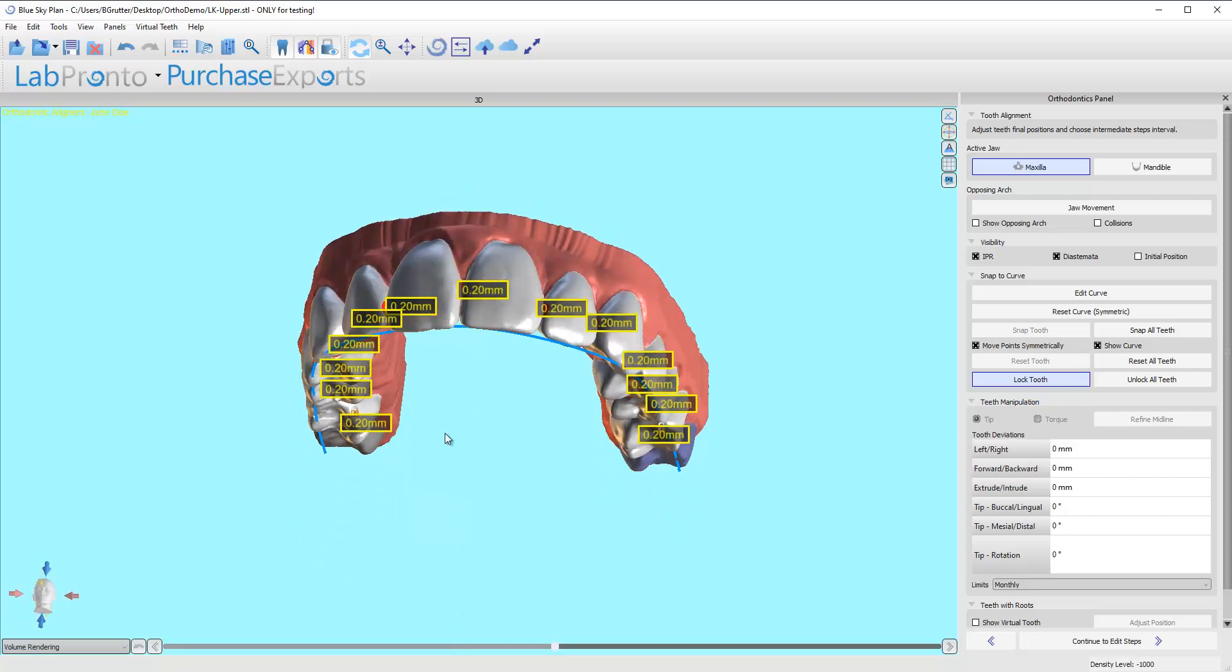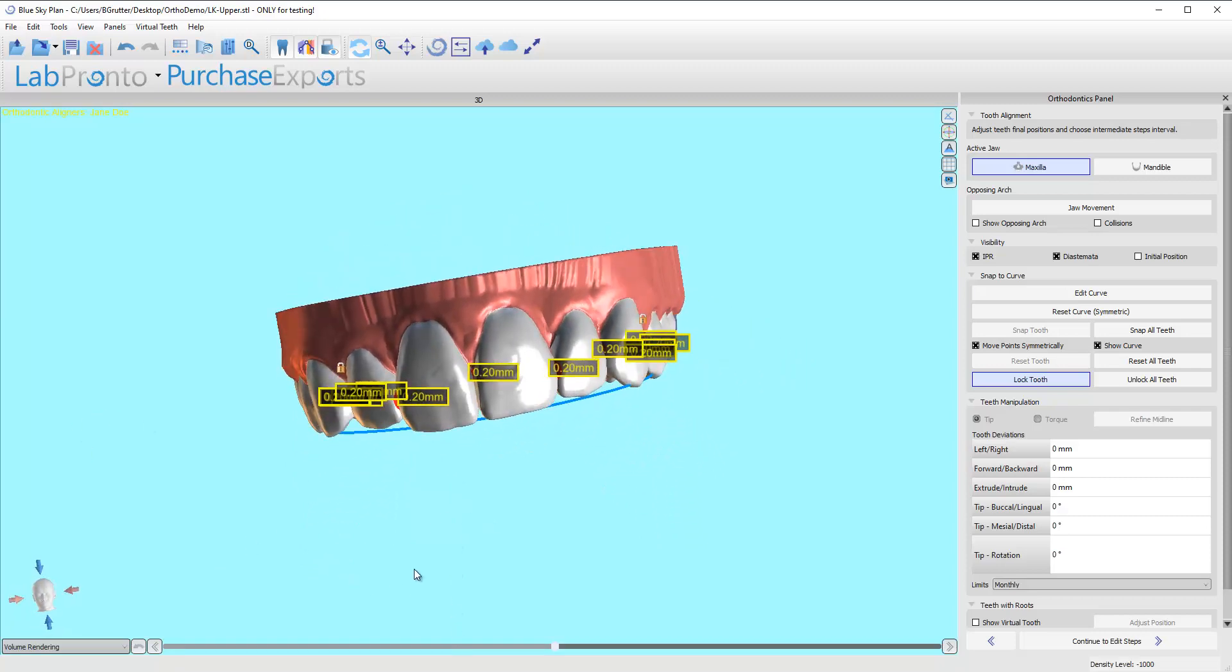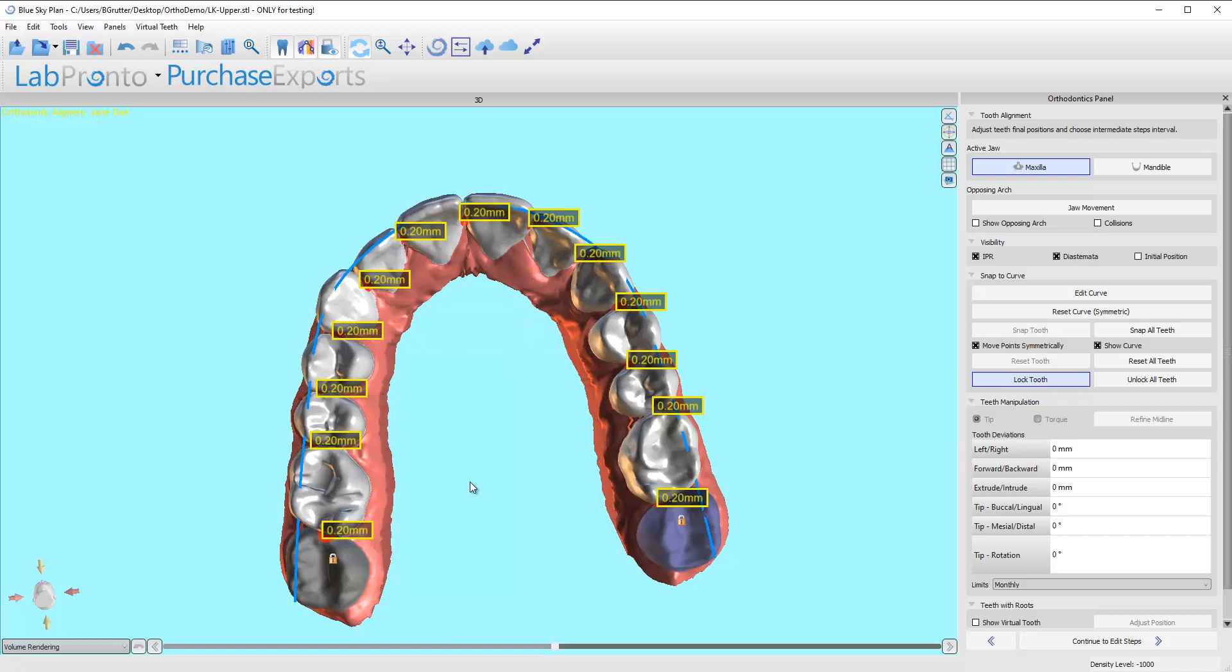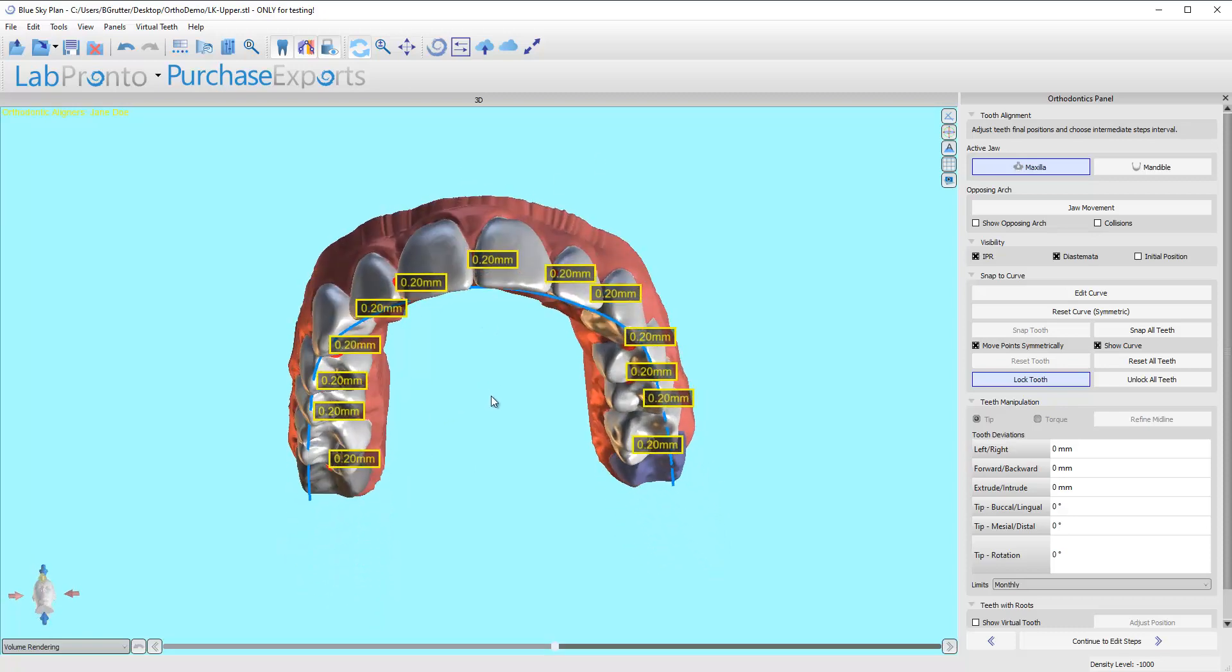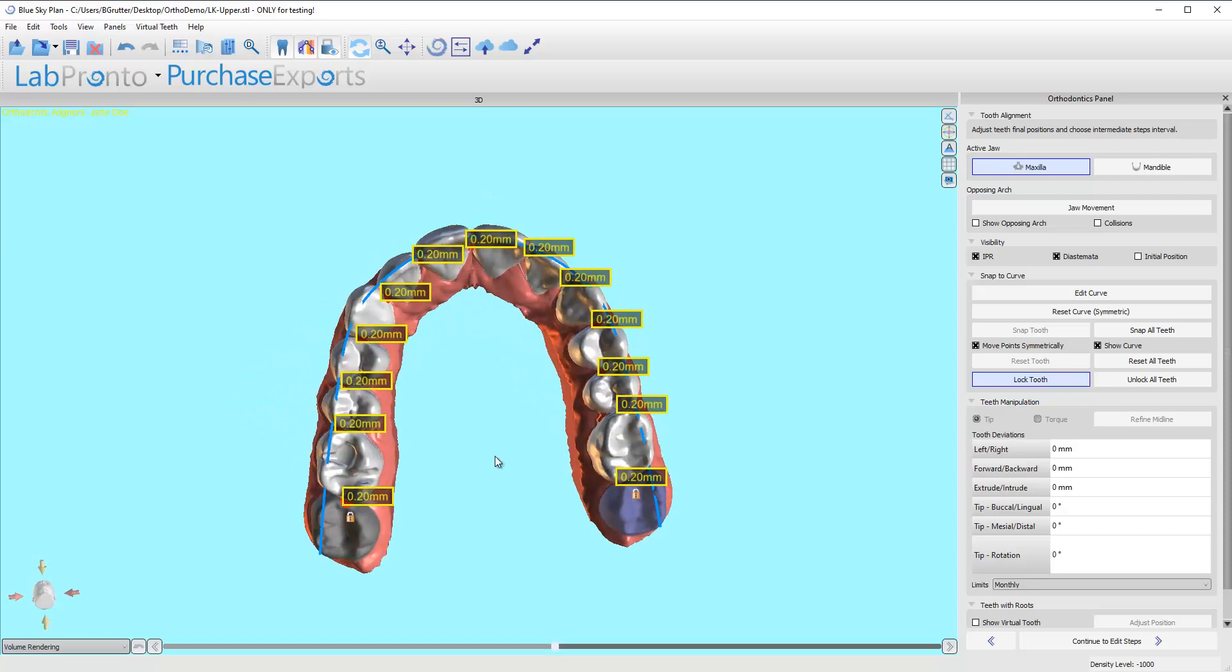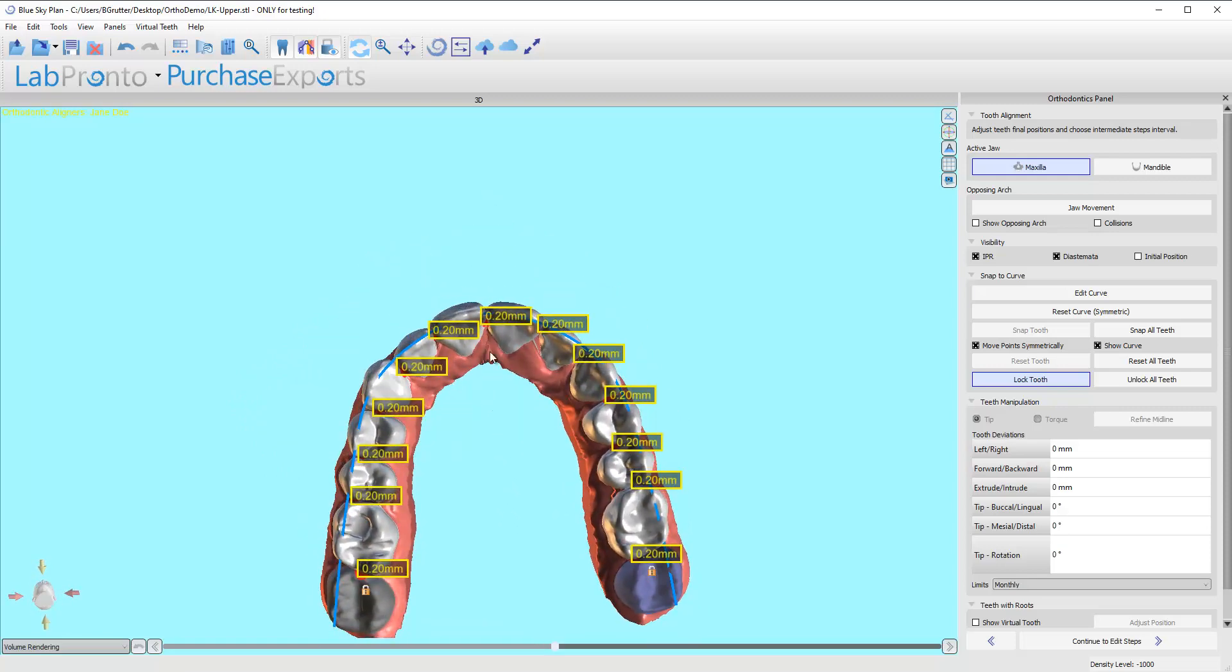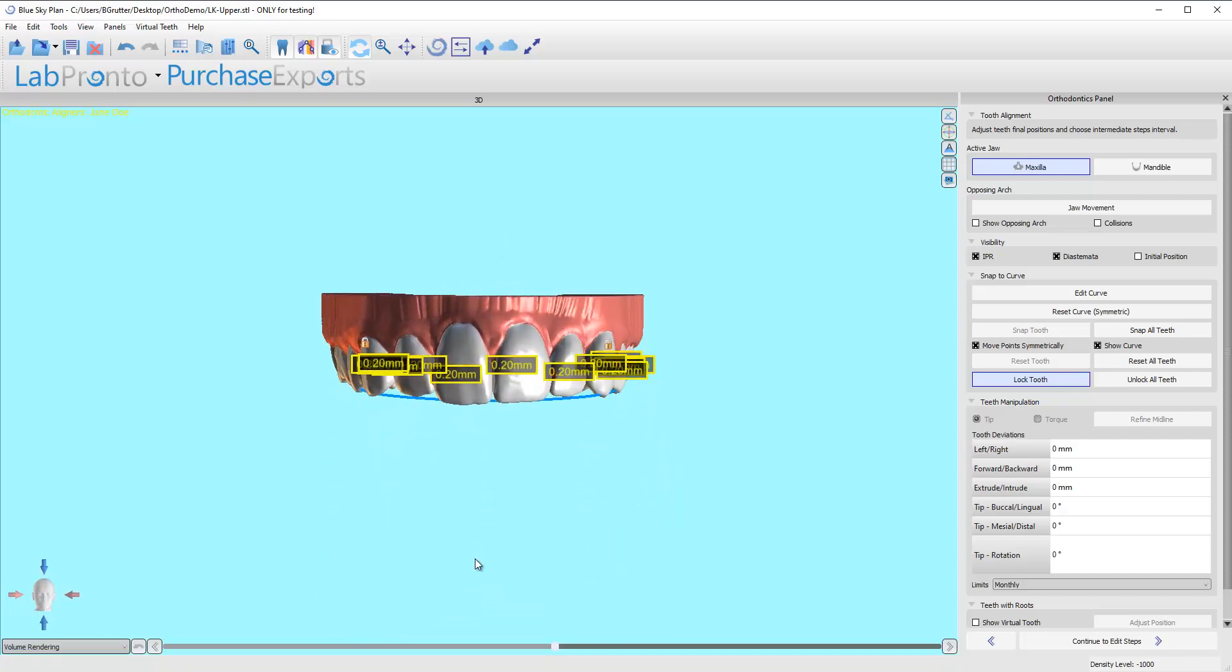I'm going to give you a little behind-the-scenes view for me: I will typically only IPR on this case basically 0.1 to 0.15, basically a strip through there, open up the contacts pretty smoothly, and leave it there. By doing that, I'm underdoing the estimated IPR, but the truth is the software kind of has to guess a little bit. So I would rather have to do a little more IPR throughout treatment—just do that little rounded-down version at the beginning and kind of see where I need it in the future. So we got the IPR looking pretty good.